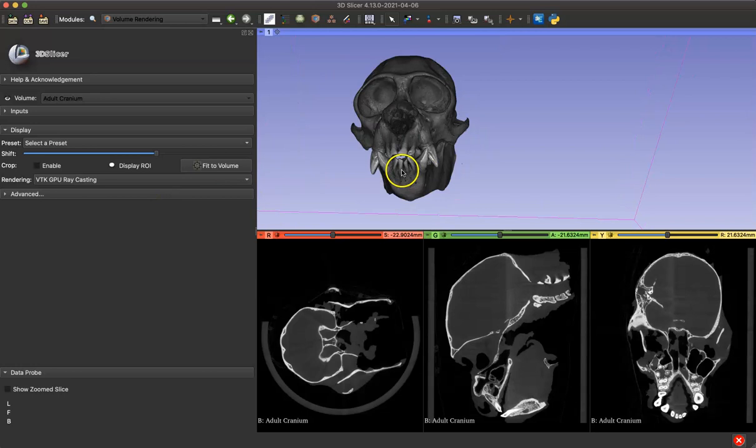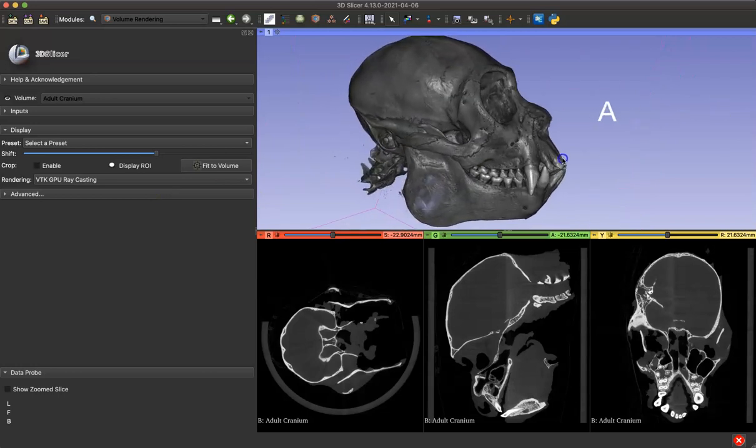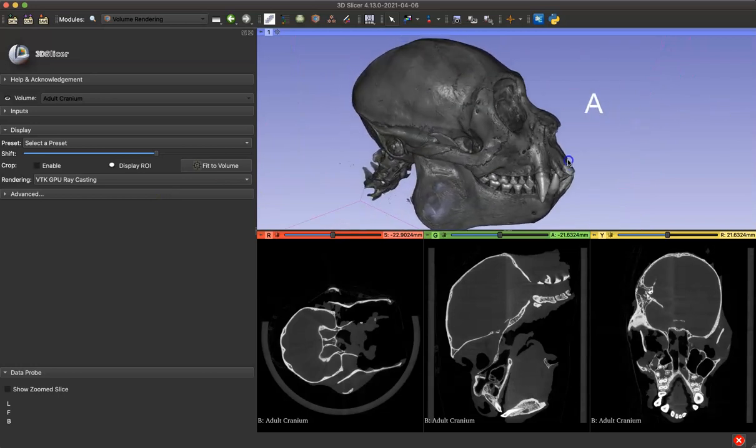And there you go. That is just a quick tutorial on how to upload TIFF stacks into Slicer.